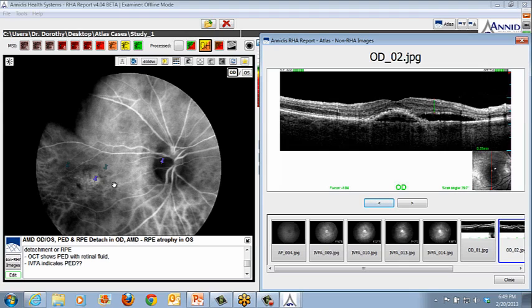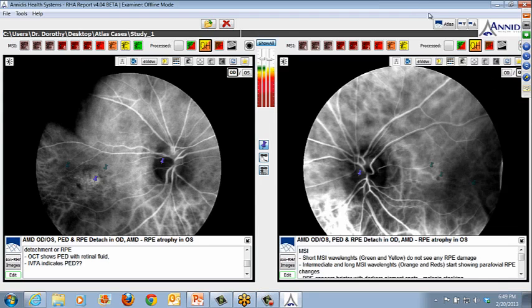So you'll really be able to toggle back and forth, look at the multispectral images, OCT, and IV fluorescein, and whether you have one or all of those modalities, there should be something there that you can identify with and get your clinical bearings. As I said, there'll be a variety of pathologies. You'll be able to click right here on the Atlas and reference all of those. I'm not going to go through the few cases that we have here.